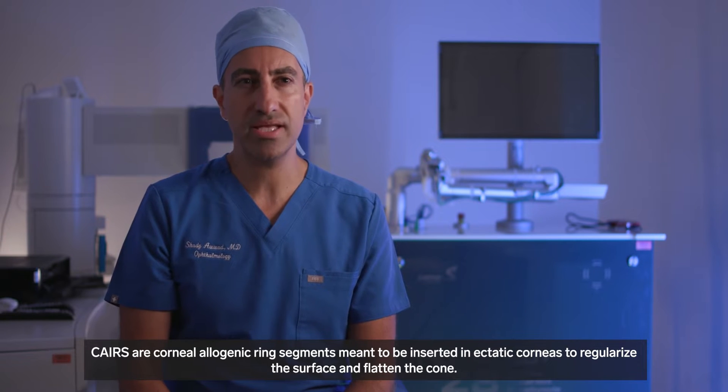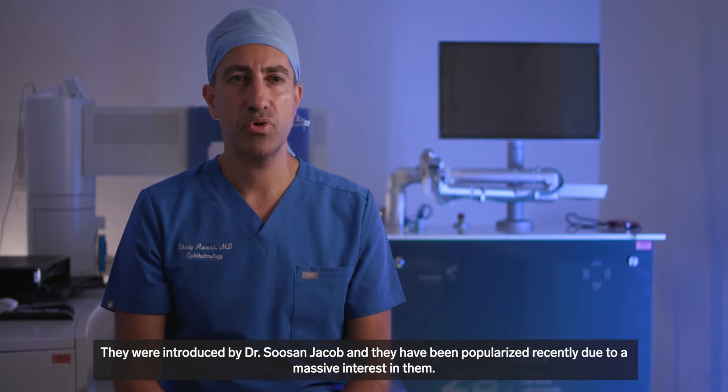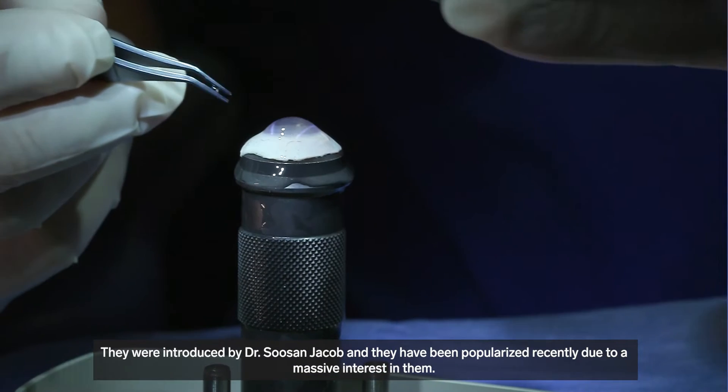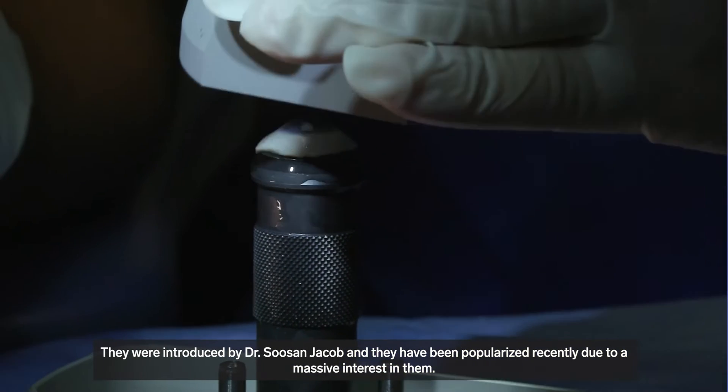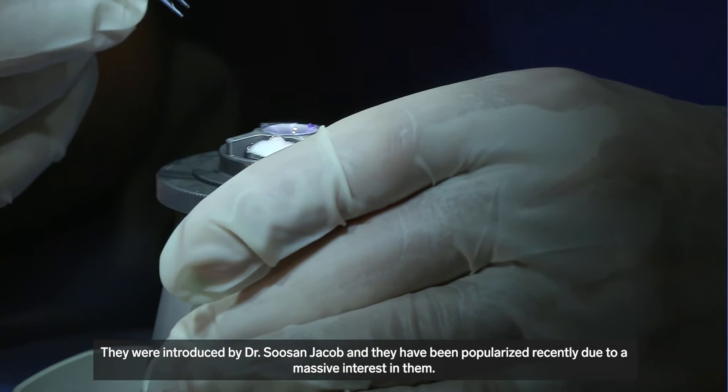CAIRS are corneal allogenic ring segments meant to be inserted in ectatic corneas to regularize their surface and flatten their cone. They were introduced by Dr. Soosan Jacob and have been popularized recently due to a massive interest in them.